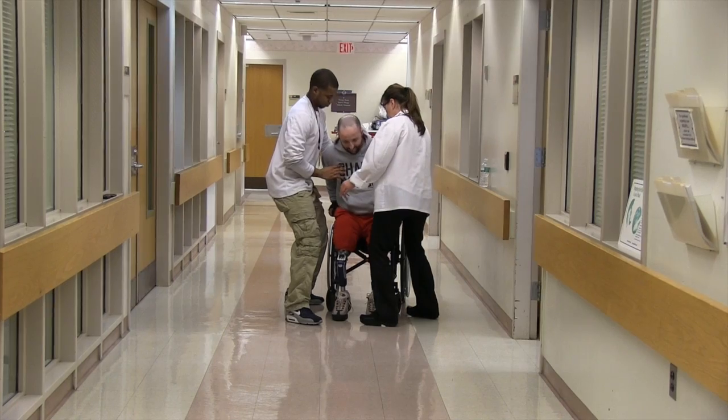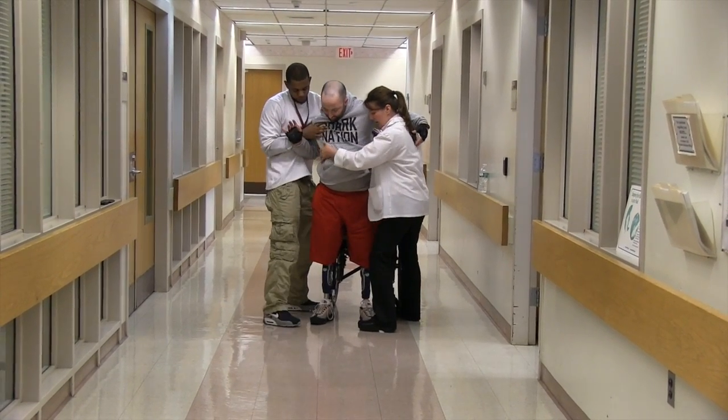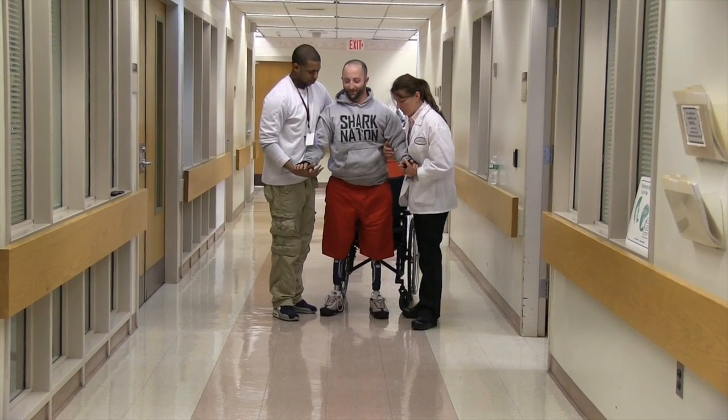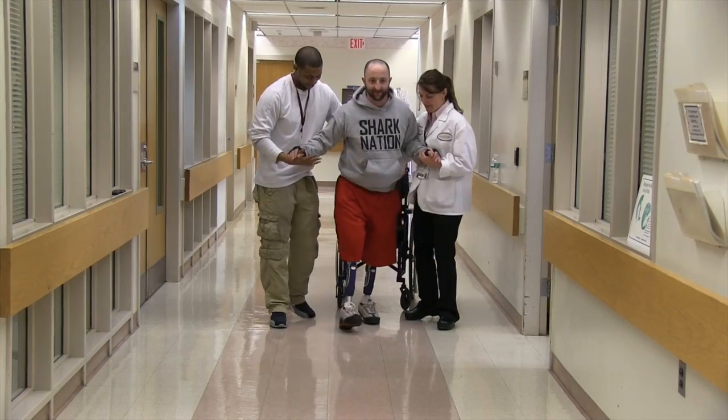Try to push it up. Way down it, way down it. And then you got it. Once you have it way down, then they're never going to buckle. It's like a scare — it's gotta get used to it. You gotta trust it. Trust me.